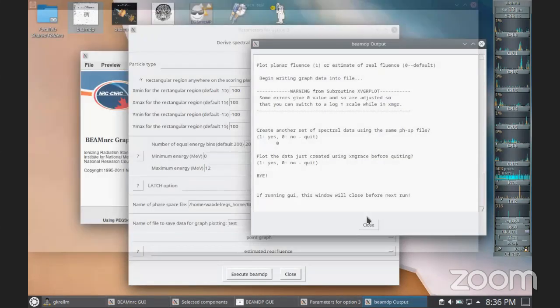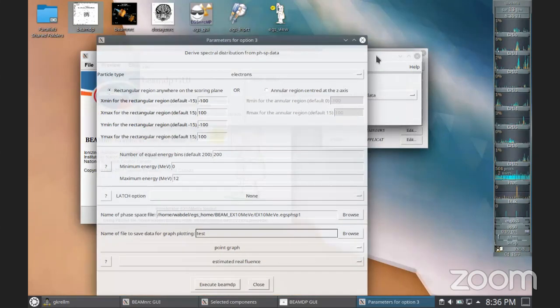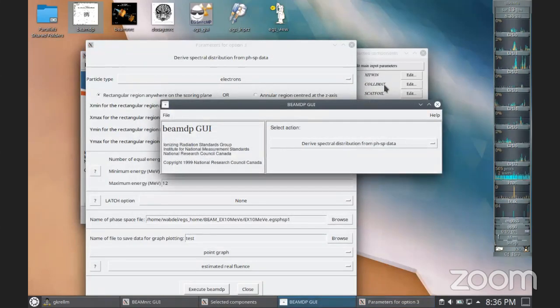Okay, we can go and look at the electrons. So the electrons, what are you expecting the distribution to look like? Anyone knows? So I want to look at the energy distribution for the electron beam, the spectrum. It will have a lot of noise. My question is about the shape. How does the shape look like? Like a photon beam where you have the spectrum curve going from zero up to the maximum, or something else.